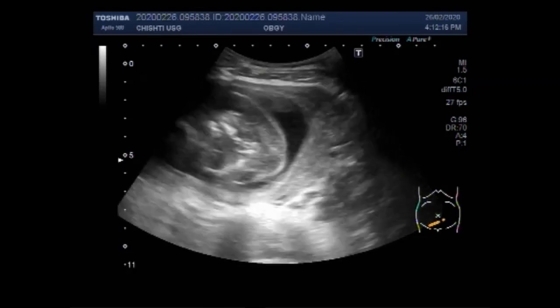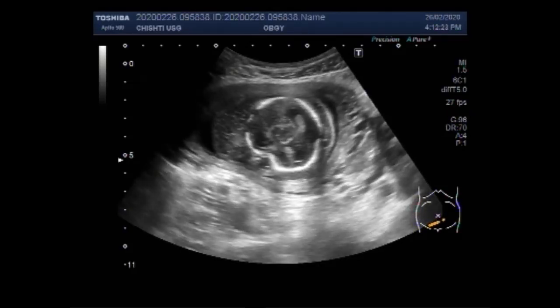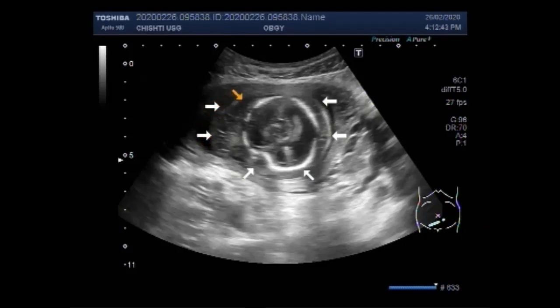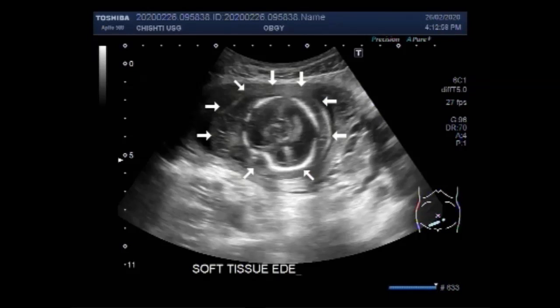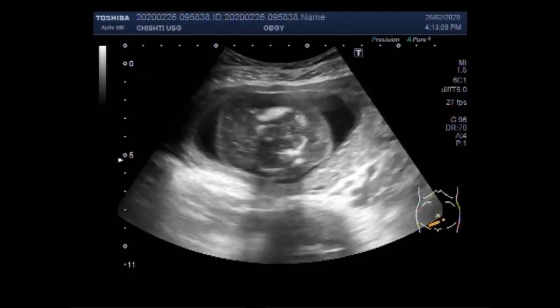Soft tissue edema is also seen along the body of the fetus. You can see the fetal head and the soft tissue edema surrounding it. The edema in the soft tissue around the fetal head is clearly visible throughout.